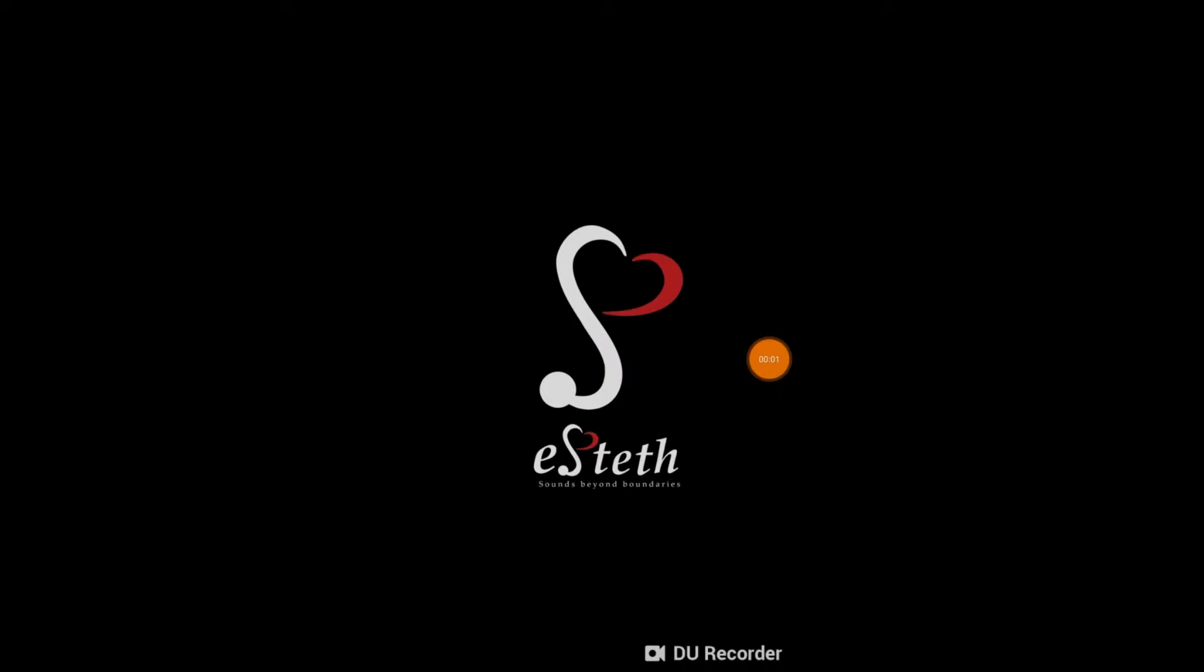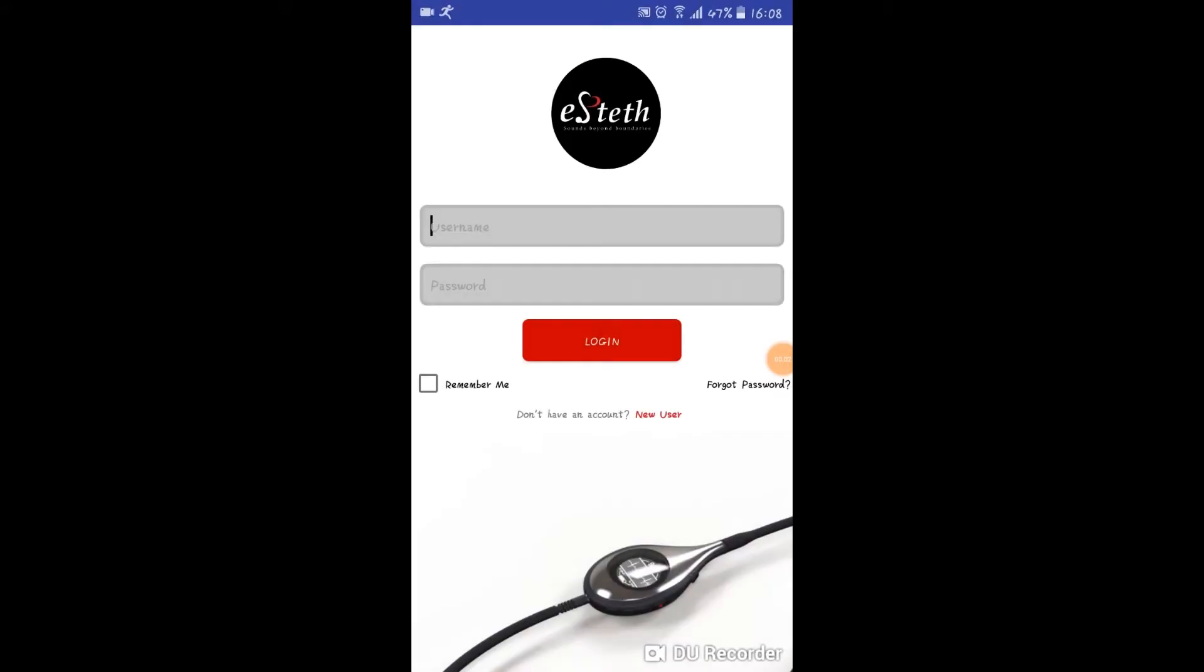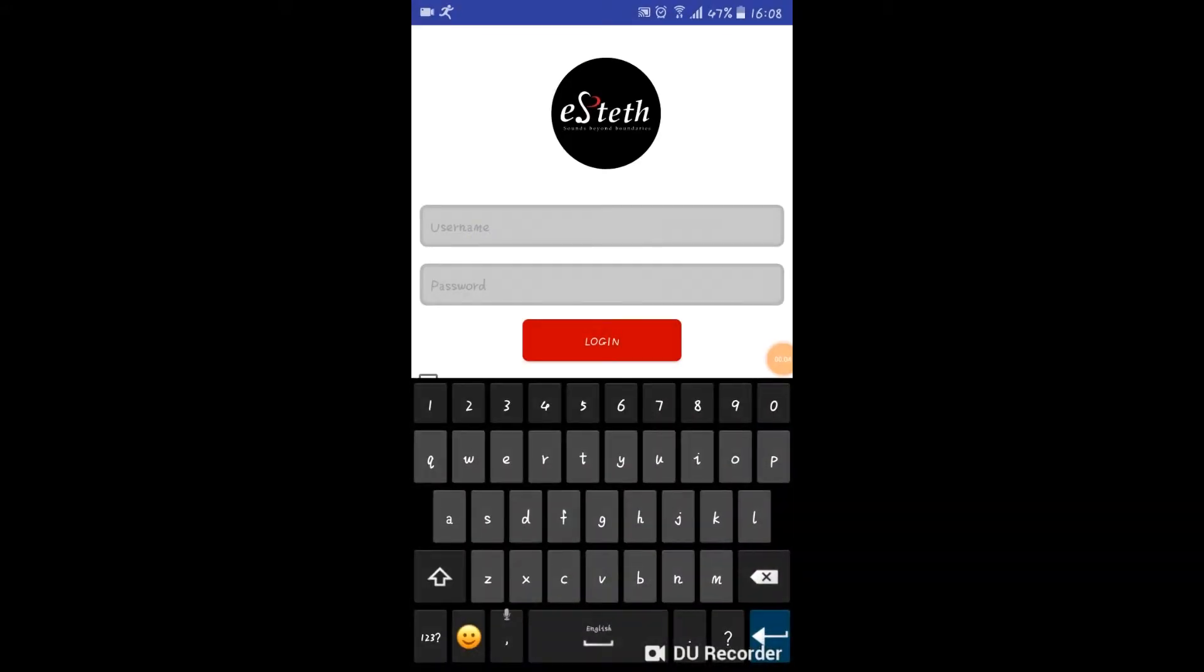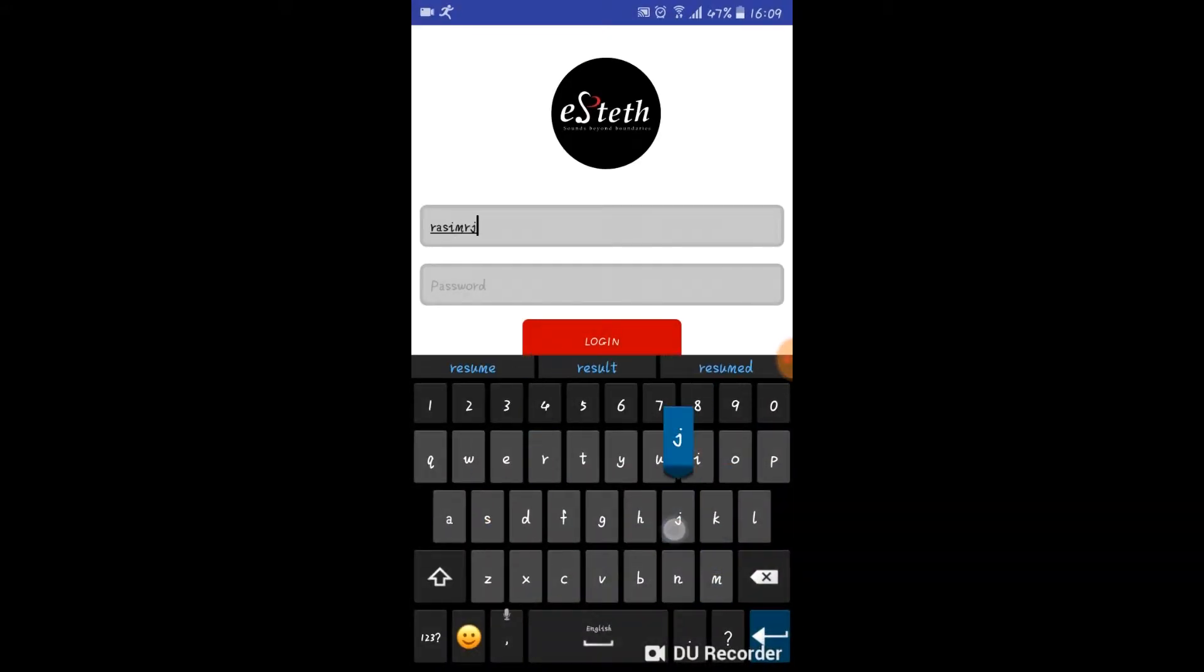E-steth is a unique digital stethoscope that comes with an application that is free of cost. You can simply download it from the Google Play Store and then sign up, or if you have an account, sign in with your ID and password.